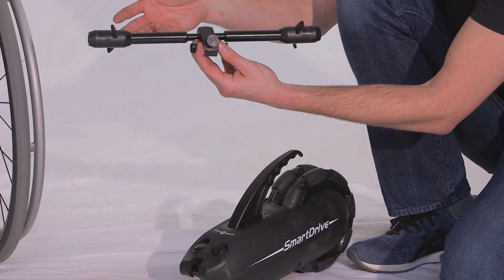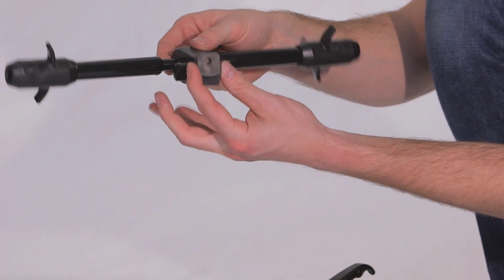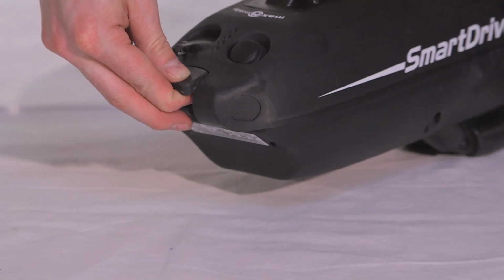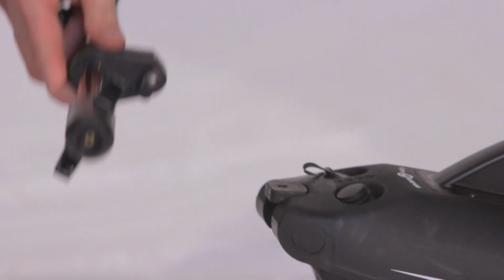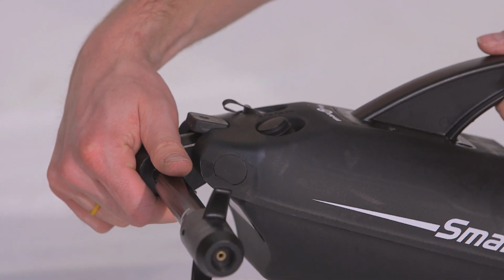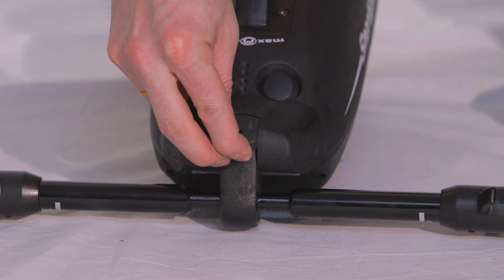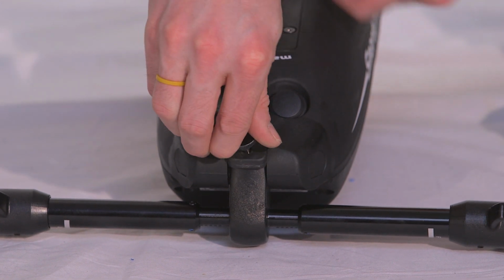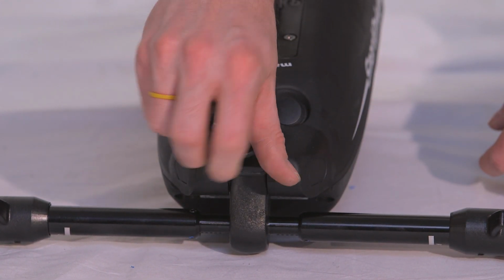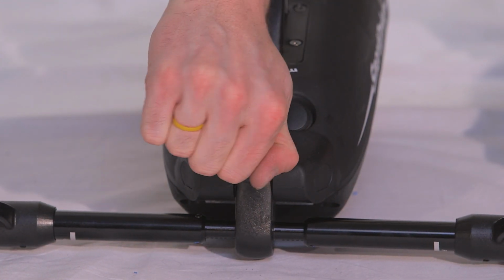For drive unit attachment, you'll need to first remove the thumb screw and rubber insert. Next, you'll want to take the rubber insert and slide it into the gap at the top of the drive unit. Now, lower the drive unit over the adapter T extrusions and then rotate the bar down until it can't rotate anymore. With the holes aligned, you should be able to easily take the set screw and fasten the rubber insert into place. Be sure to tighten this as much as you can, as you want to be sure to sufficiently secure the drive unit to the adapter bar.